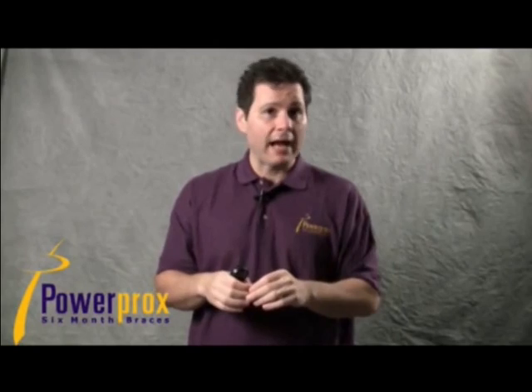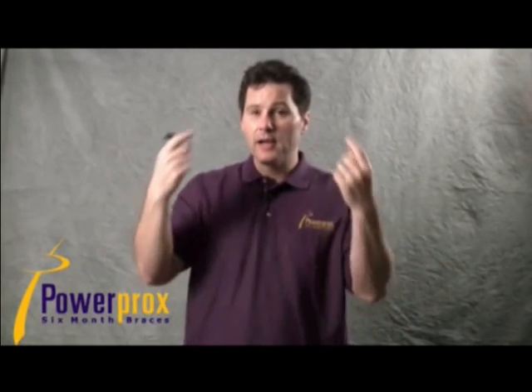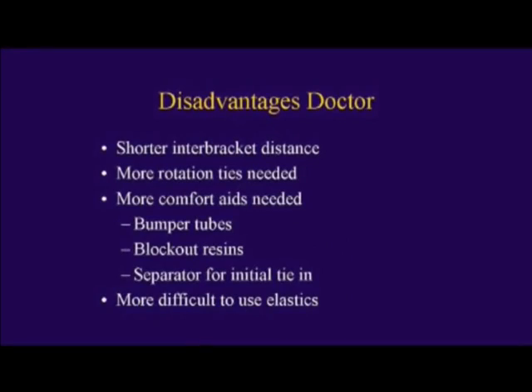I also like to use blockout resins or even flowable composite right on the terminal part of the end wires where they're coming out of the molar tubes in lingual, because any extra wire on the labial, it's not going to really bother their cheeks too much, but on the lingual, every time they swallow or move their tongue, they may nick the side of their tongue. So I like to have some blockout resins placed initially.